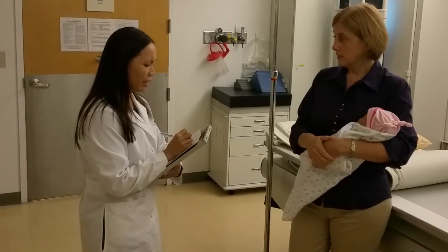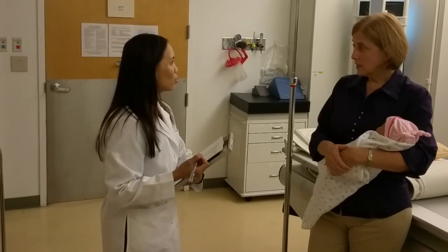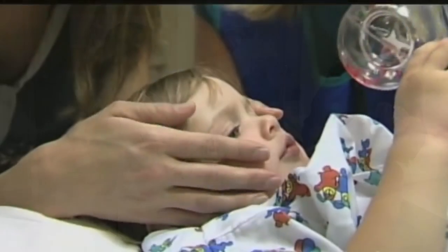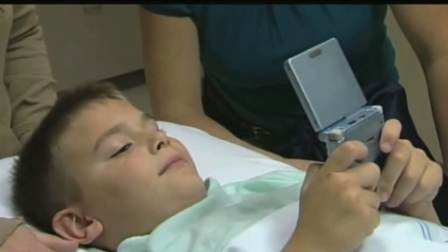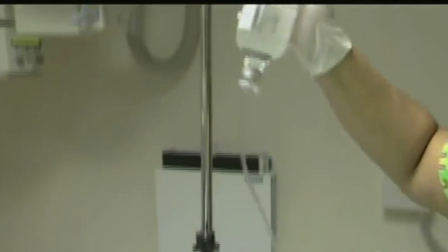Make sure you explain the examination in detail to the parent to let them know what to expect. I encourage at least one parent to stay in the room to help the child cope, to praise them, to talk them through the procedure, and to assist with the use of distraction techniques. Distraction techniques such as toys, videos, and books have been shown to reduce stress and help the child cope with the examination.